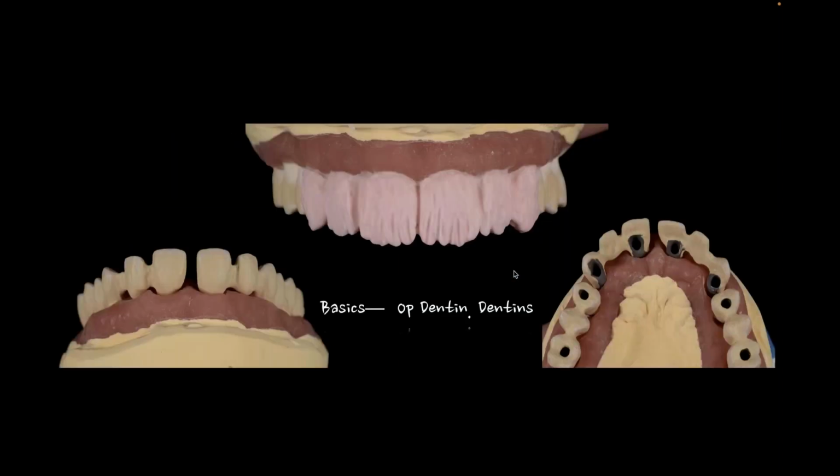So we did everything that we would normally do. We developed a diagnostic wax up. We figured out where the incisal edge was. This became an implant case, and it was designed very well by a friend of mine, Dr. Dane in Ohio. And what he did was he actually had all the implants placed where we could section this out into three-unit bridges. I know the all-on concept is so popular today, and in some cases, I get why we're doing them. In other cases, when we could stick to crown and bridge, we should.